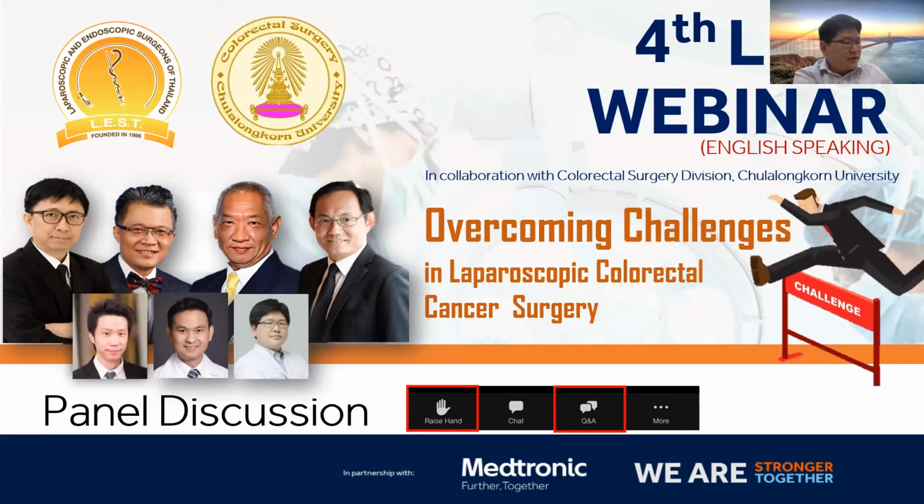For the next question, about the intracorporeal anastomosis, do you also test it with a reverse air leak test? Okay. If I do the hand-sewn intracorporeal anastomosis, I never do the air leak test. But if I make the anastomosis with a stapler, I always use the air leak test.